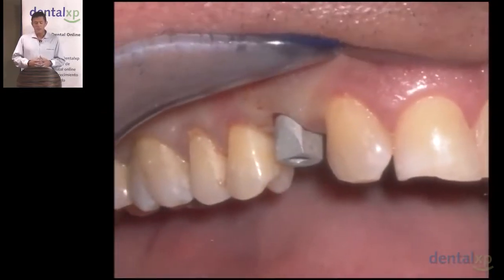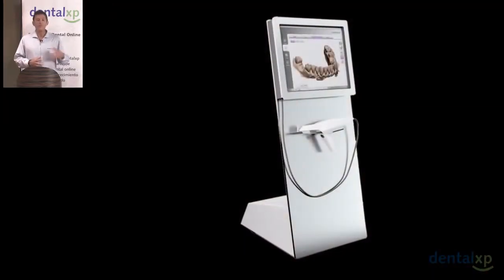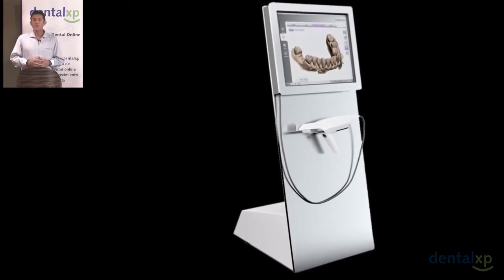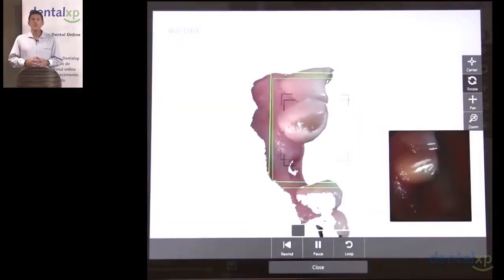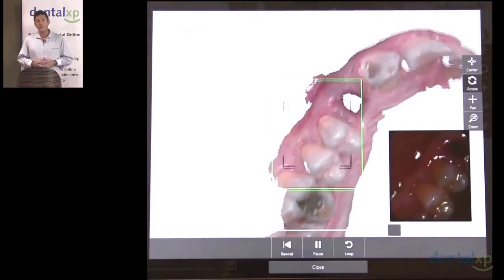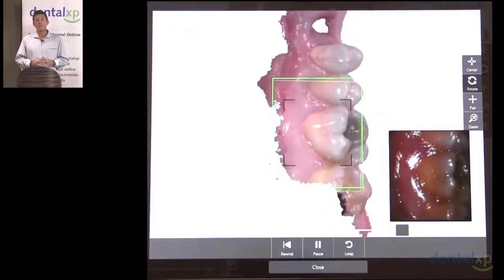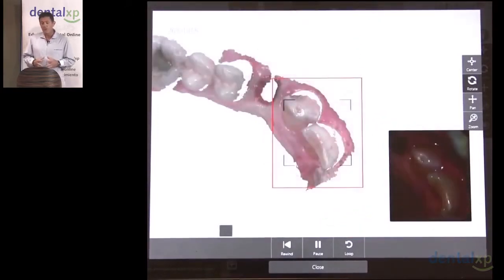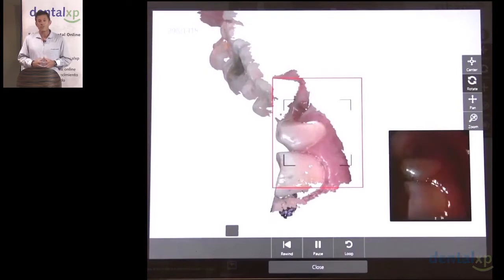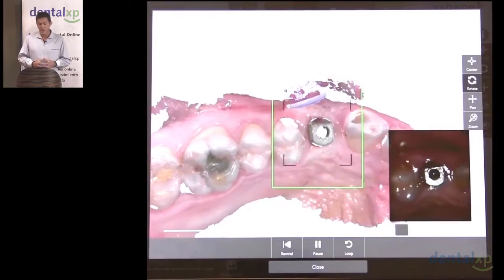This is a dual purpose scan body which allows us not only to scan the implant the day of surgery and send it off to the laboratory utilizing a digital file, but also allows us to utilize it as a temporary restoration as well if we so wish. We're going to utilize the 3Shape optical scanner to scan the soft tissue first, then scan the implant body and the scan body, which will transfer the information to the laboratory. This gives the laboratory the opportunity to start the processing of the final permanent abutment and restoration, but can also facilitate an immediate provisional restoration within a few days' time.